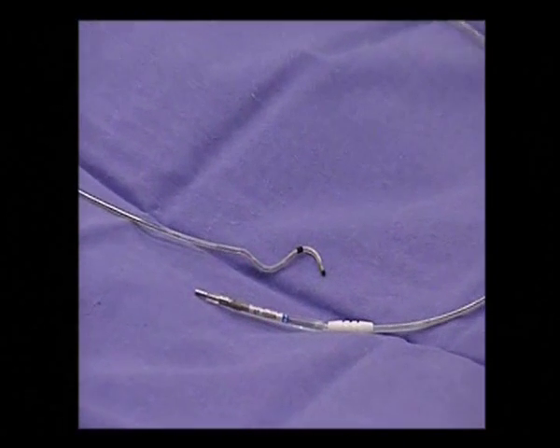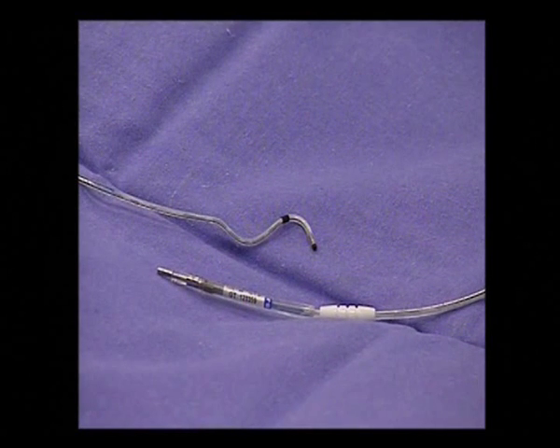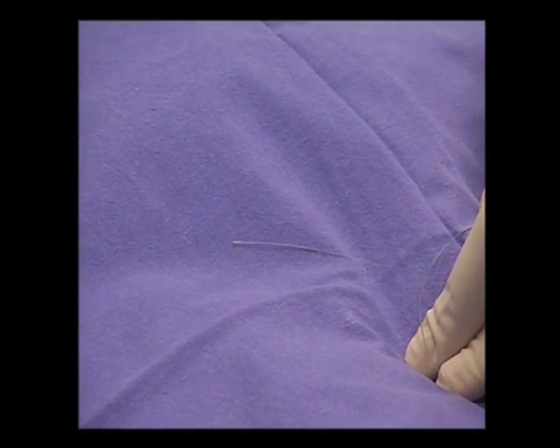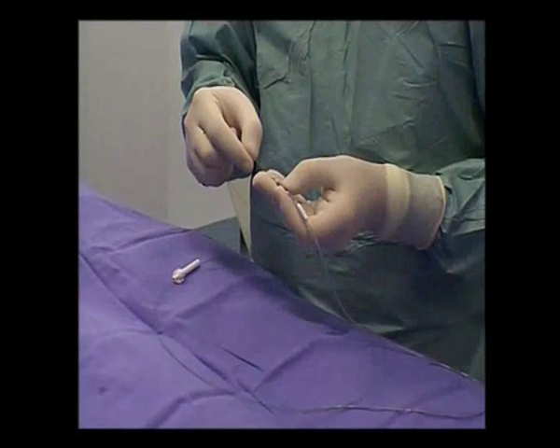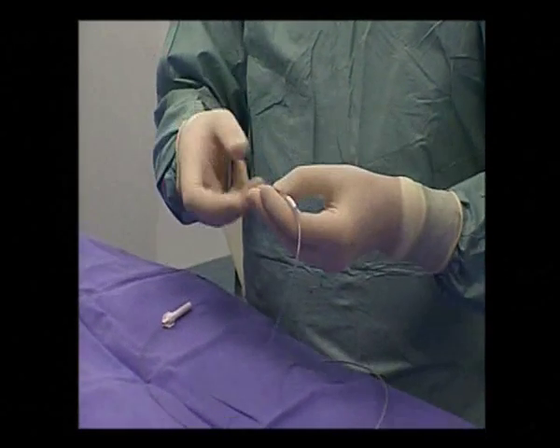This is the coronary sinus lead. The lead's pre-shaped S-curve distal end tip is designed to allow optimal steerability and passive fixation. This is the magnetic guide wire, which is inserted into the lead, allowing engagement of target vessels by remote guidance. The magnetic guide wire is now inserted into the coronary sinus lead.